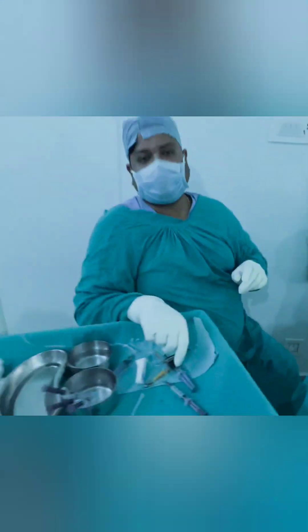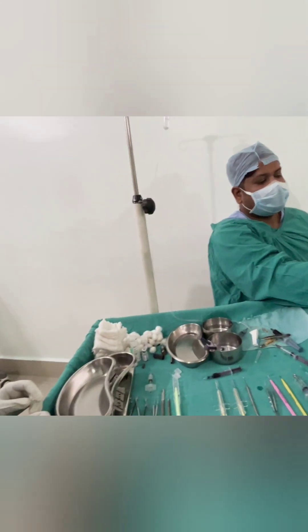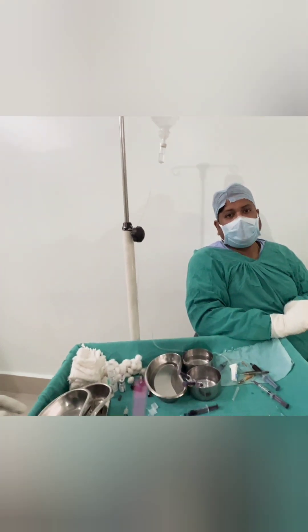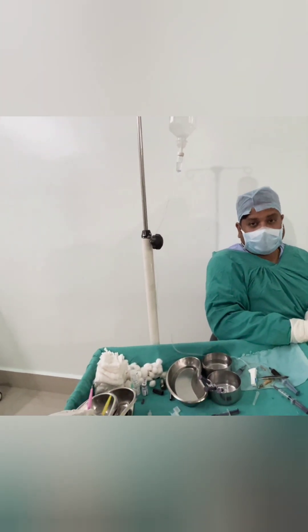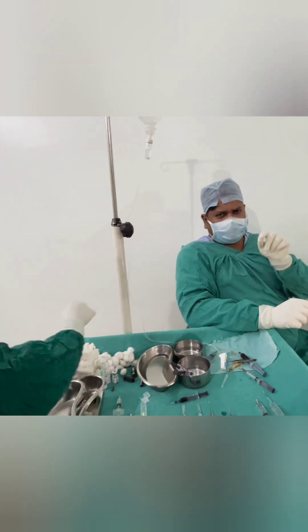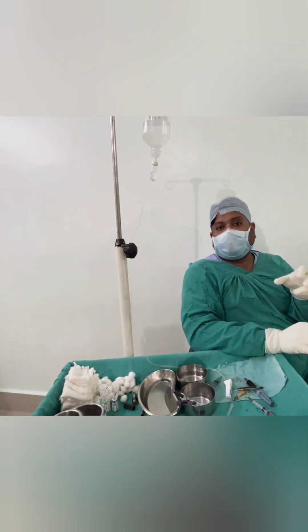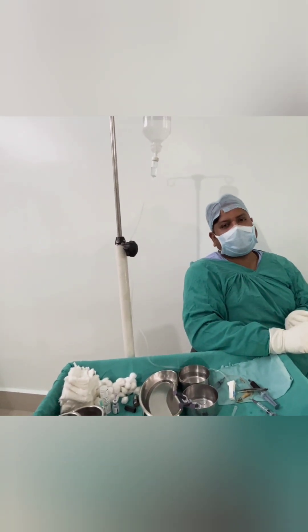To summarize: in a case of immature cataract, the key step is to have a good technique for the direct chop. First, make a small groove — that is the main part. With the groove, we can have a good hold with the active chopper, and then we can proceed with the right action. Thank you.